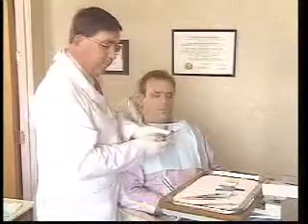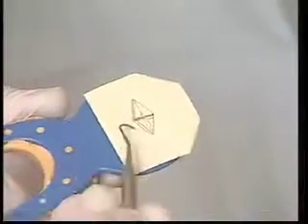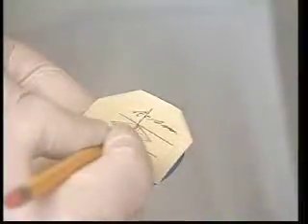Now, what we have is a perfect Gothic arch tracing. The Gothic arch tracer has diagrammed the patient's range of motion. In this case, the range of motion is 10 millimeters. Ranges of less than 7 millimeters may be a limiting factor for successful treatment. There is no restriction of movement to the sides. We have also established the patient's midline.